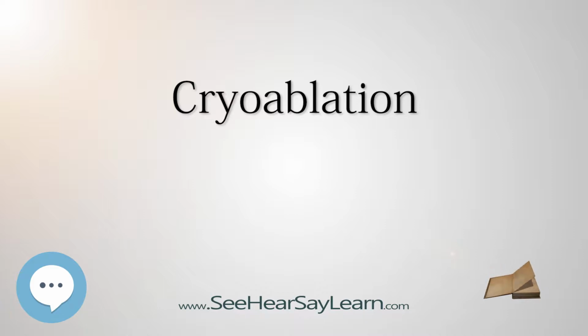The most common application of cryoablation is to ablate solid tumors found in the lung, liver, breast, kidney, and prostate. The use in prostate and renal cryoablation are the most common. Although sometimes applied in cryosurgery through laparoscopic or open surgical approaches, most often cryoablation is performed percutaneously, through the skin and into the target tissue containing the tumor, by a medical specialist such as an interventional radiologist. The term is from cryo plus ablation.